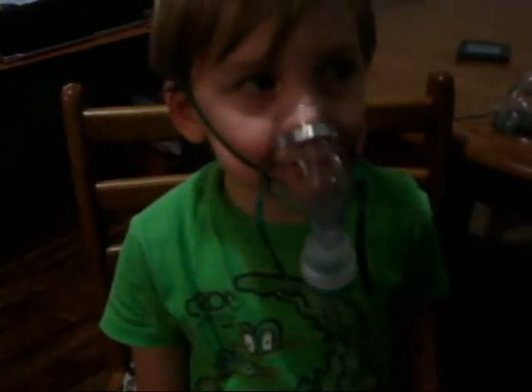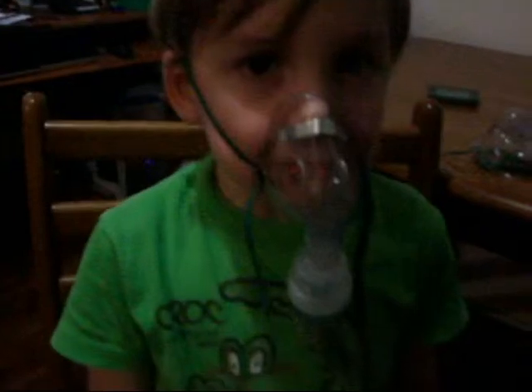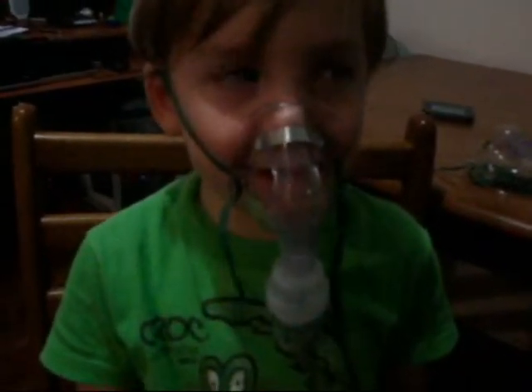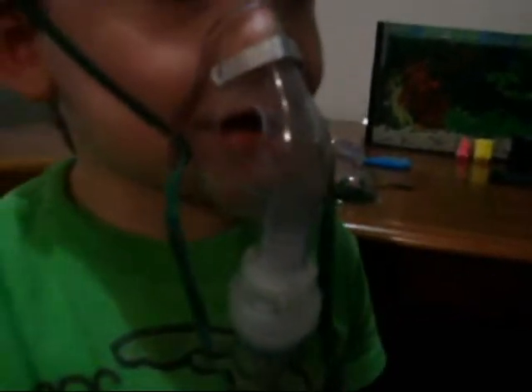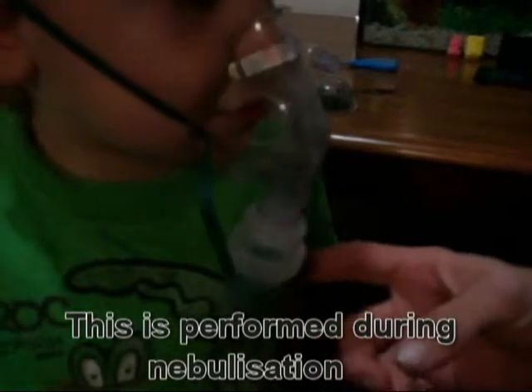When the machine is turned on, the mask will mist. Ensure that the child is sitting upright and breathes normally. Occasionally tapping on the canister to ensure that it continues to mist evenly.